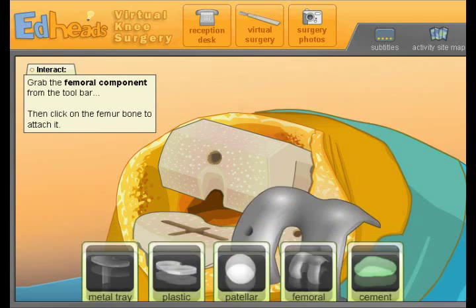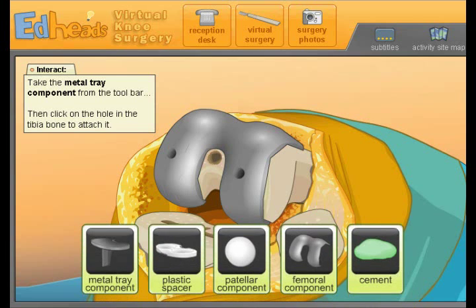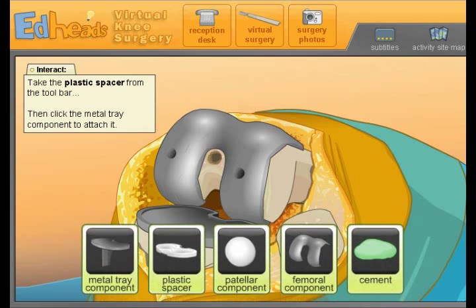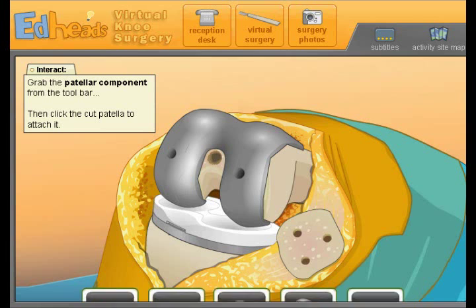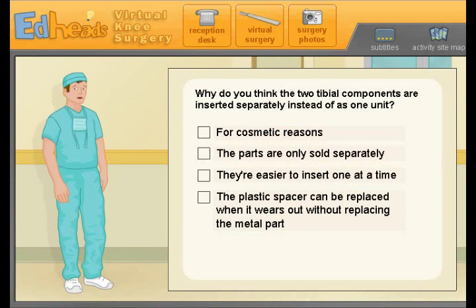The femoral trial component — attach the metal tray trial component to the tibia, insert the plastic trial spacer into the metal tray component, and lastly attach the patellar trial component. Why do you think the two tibial components are inserted separately instead of as one unit? The plastic spacer can be replaced when it wears out without replacing the metal — fantastic!